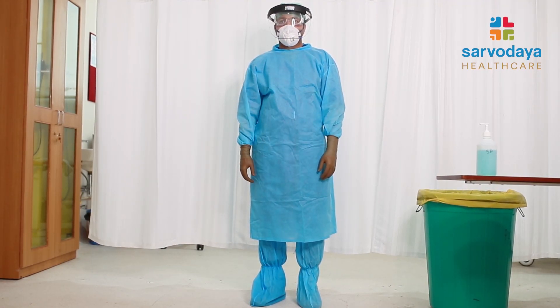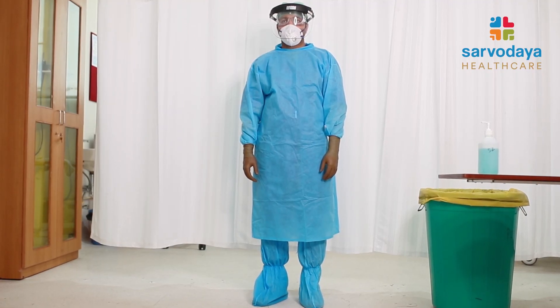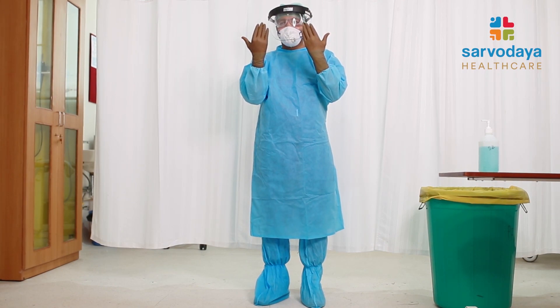Therefore, the most care should be taken while we deglove or remove these contaminated surfaces. The least contaminated areas would naturally be the back of the gloves.